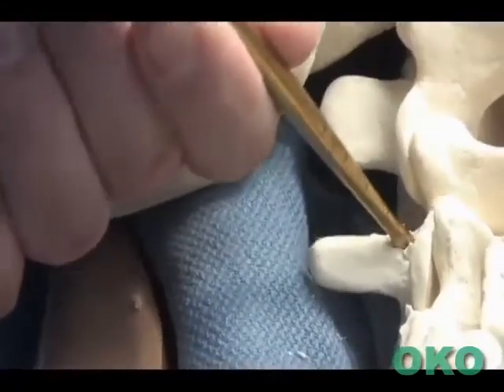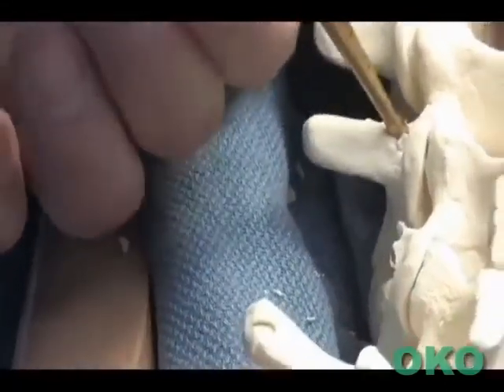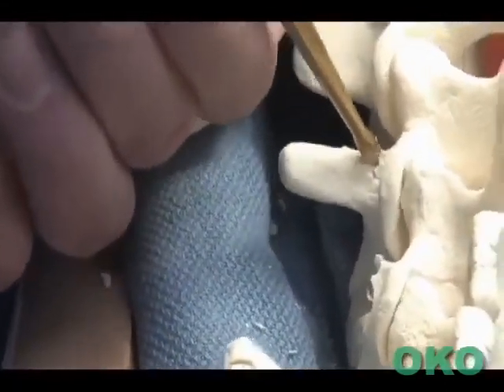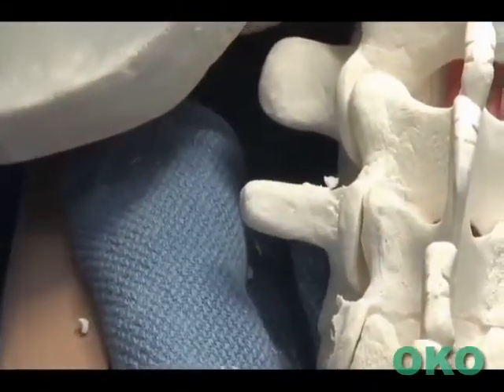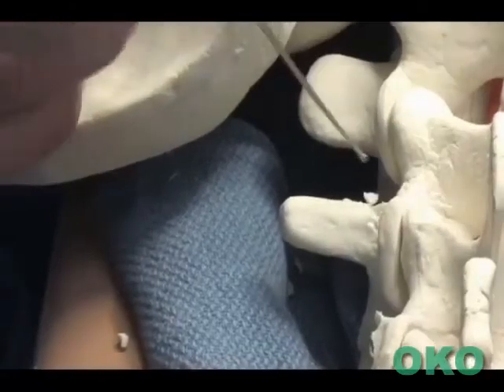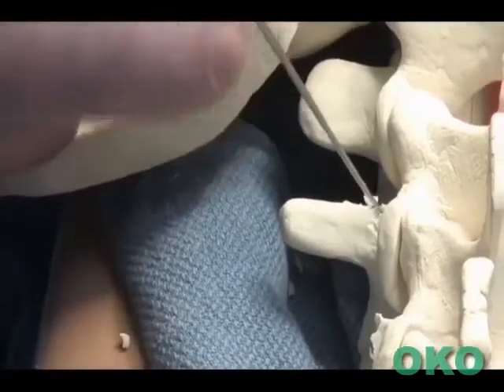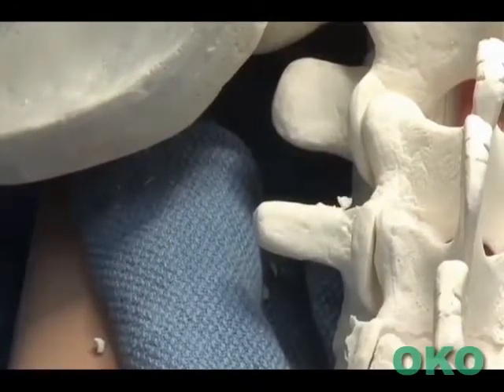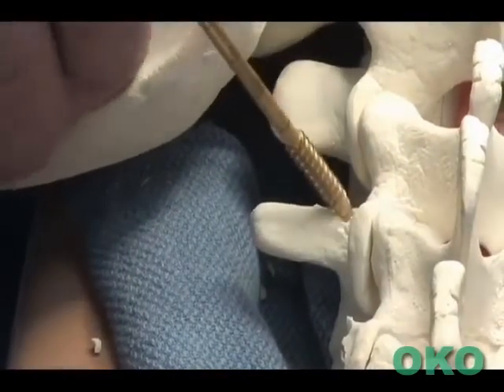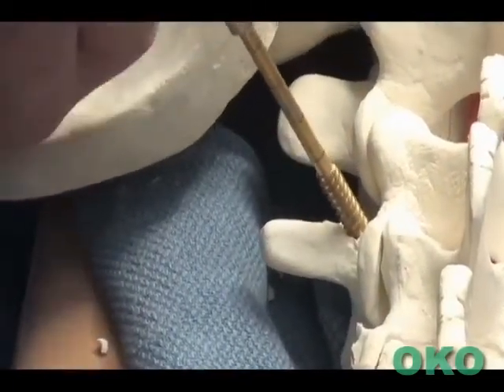Once it is advanced to 30 or 40mm, the pedicle finder can be removed, and then the path sounded with the ball tip feeler, ensuring intact medial and lateral walls as well as cranial and caudal, and the ventral floor of the vertebral body.